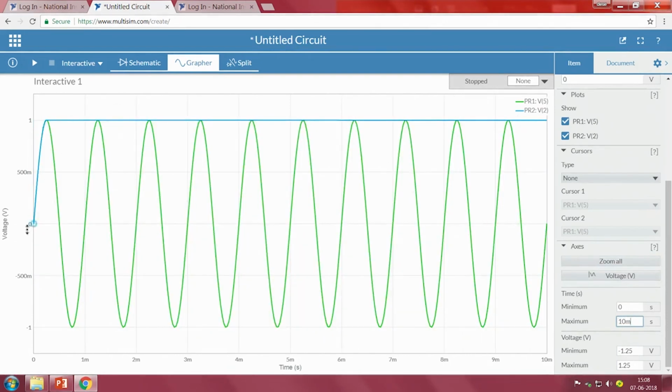If we observe, the output initially keeps on increasing, meaning the capacitor starts charging, and it is charged to a value of 1. Why only to 1? Because the peak input voltage that we applied is only 1 volt, and since we do not have any discharging path, it is the maximum voltage that the output is providing, the capacitor is always at this particular point.